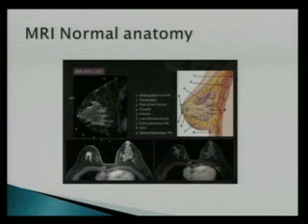And the crazy thing about MRI for breast is you're going to start looking at the images with contrast first. The subtraction images and the contrast images are actually the more important images than the others. You'll go back and look at everything, of course, but you start looking at what the contrast looks like first in breast imaging and go back and see everything else.